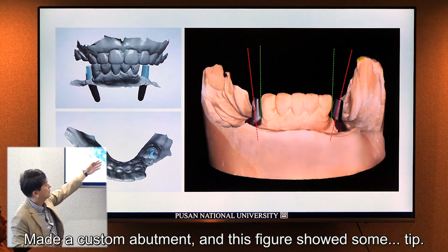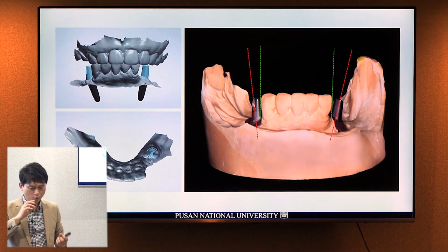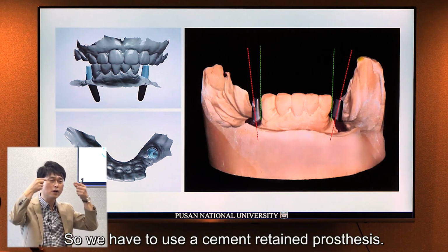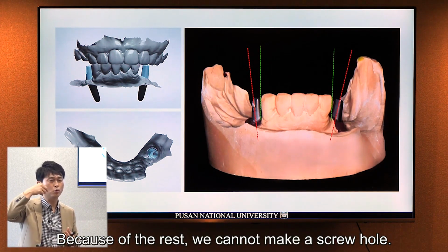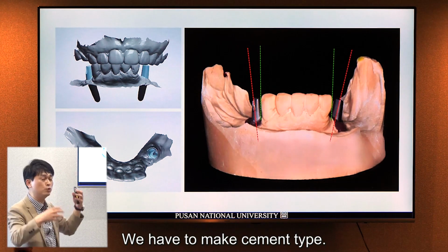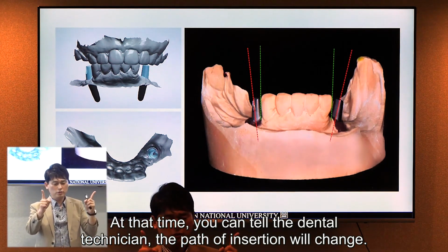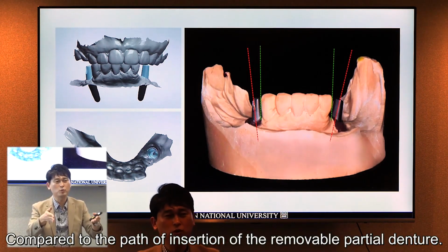So I made the custom abutment, and this figure shows some tips. When we make the surveyed crown, we cannot make the screw hole. So we have to use the cemented type prosthesis, no? Because of the rest, we cannot make the screw hole. So we cannot make the screw type prosthesis. We have to make the cement type. So at that time, you can order the dental technician: the path of insertion will be changed compared with the path of insertion of the removable partial denture.